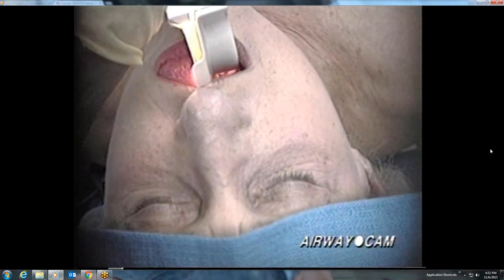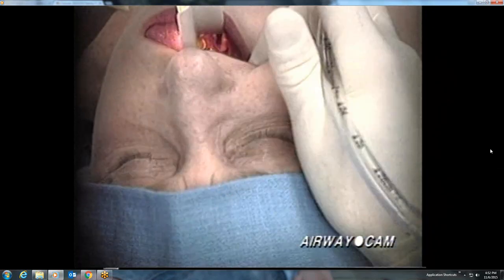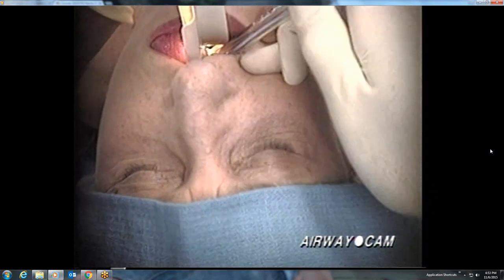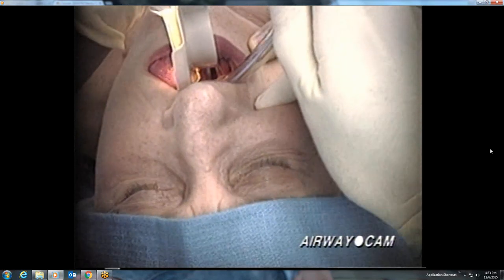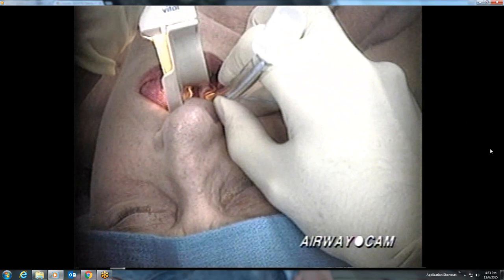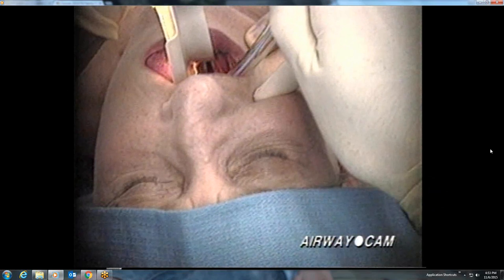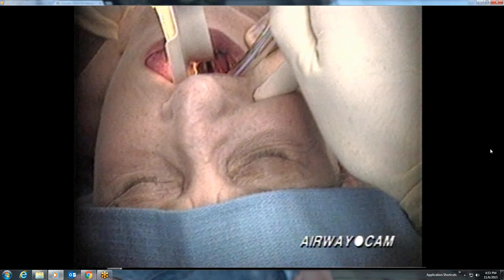The posterior cartilages come into view. The tip of the curved blade has been inserted beneath the epiglottis instead of into the vallecula. The laryngoscopist retracts the upper lip and carefully directs the tube down the right side. The tube is advanced until the cuff of the endotracheal tube has been placed beyond the vocal cords. Notice how effectively the tongue has been controlled on the left side of the mouth. The lack of upper teeth opens up the mouth and makes alignment of the larynx with the line of sight less difficult. The white of the vocal cords is well seen.